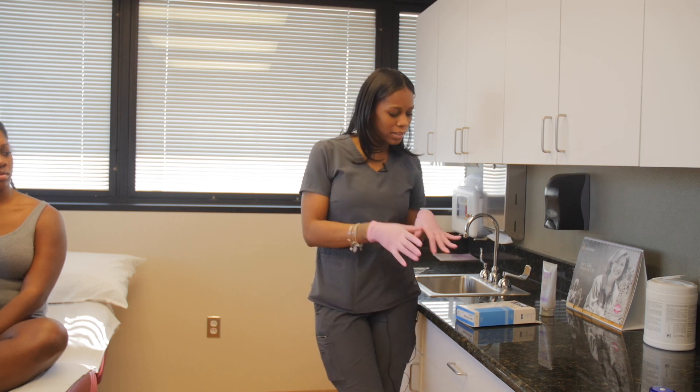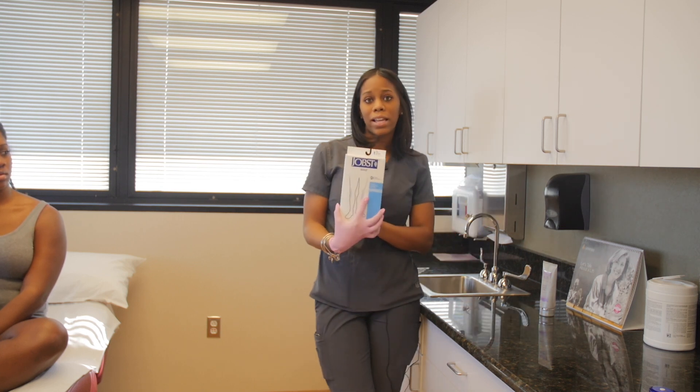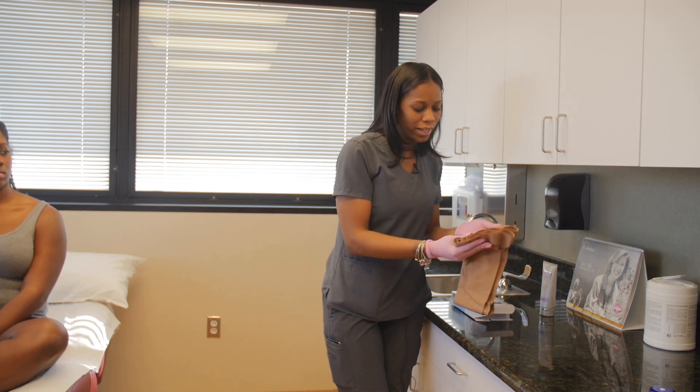I usually grab a pair of gloves because it's easier gripping up the stockings. So these are the patient stockings — it comes in a pair of two, so you have both stockings here.